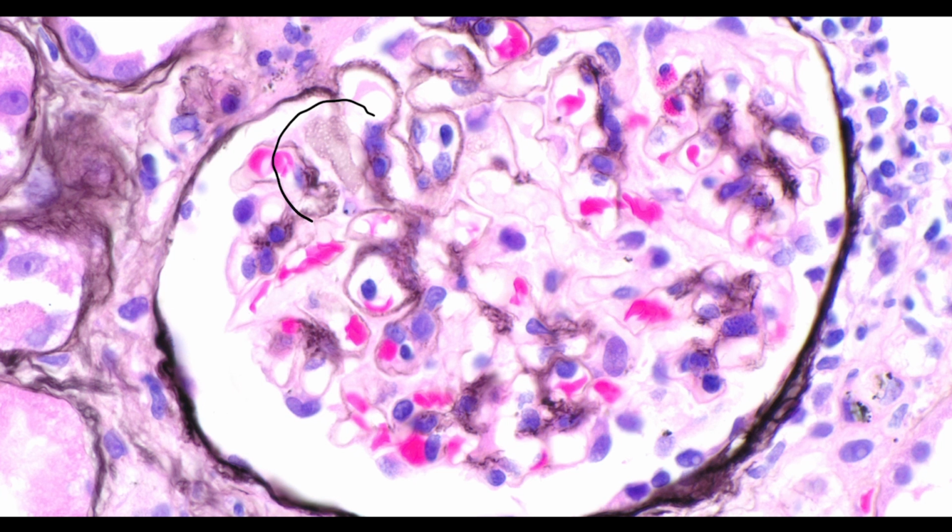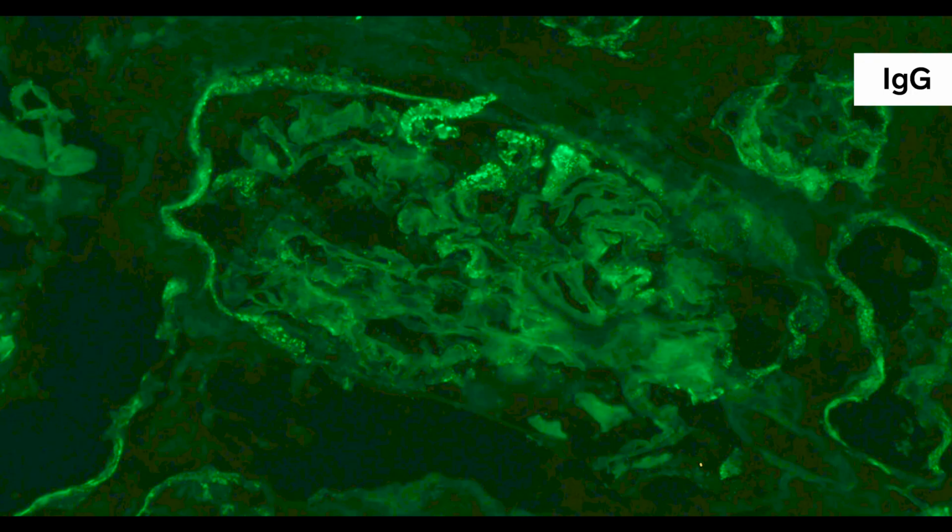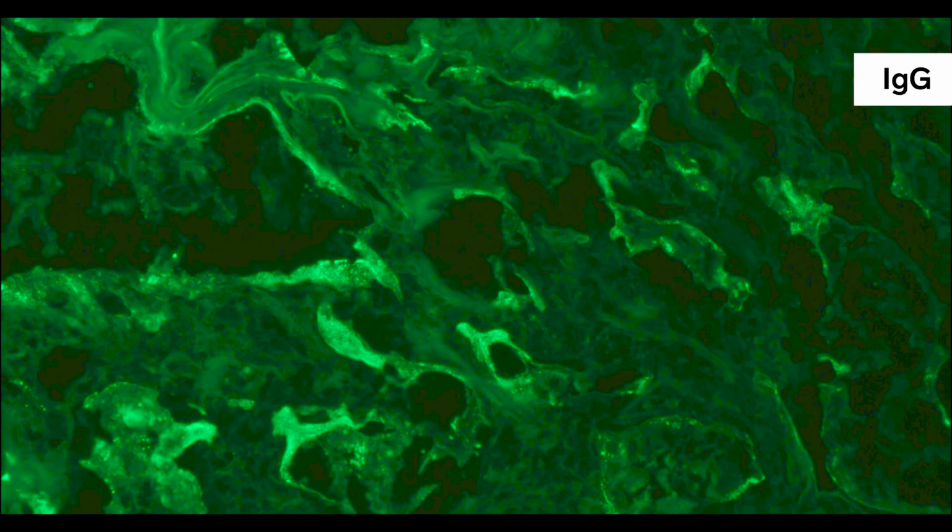Interesting. Let's see if the immunofluorescence shows anything. So here we have our immunofluorescence IgG staining. And we can see that there is strong positive reactivity here in the capillary loops, again in a segmental pattern. And we can also see it around the Bowman's capsule. This staining was similar in our C3, kappa, and lambda staining. We can also see in this image that there is a lot of staining in the IgG for tubules in a granular pattern.